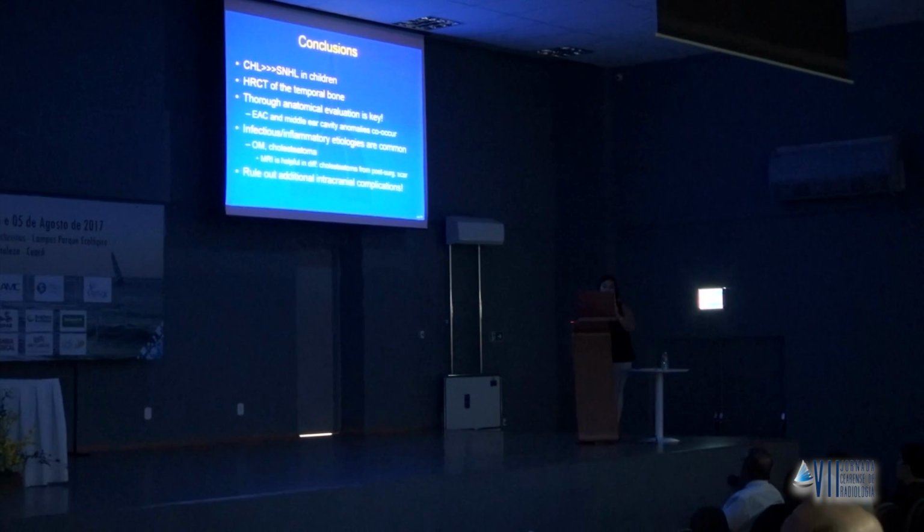Amongst the etiologies, infectious inflammatory etiologies, such as otitis media, is the most common, however, usually diagnosed on a clinical basis and does not require imaging unless there is concern for complications. MRI can be helpful in further identification of infection involvement or differentiation of cholesteatoma from post-surgical changes, and always search for potential complications in the vascular system or extension into intracranial compartments, as temporal bone is in a very critical anatomical location.